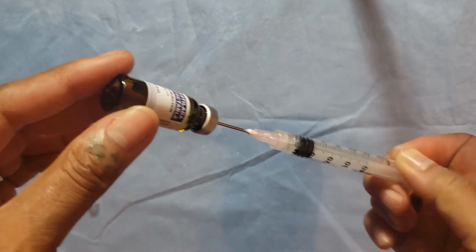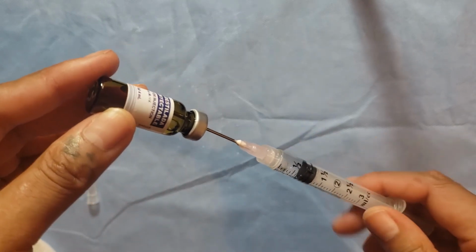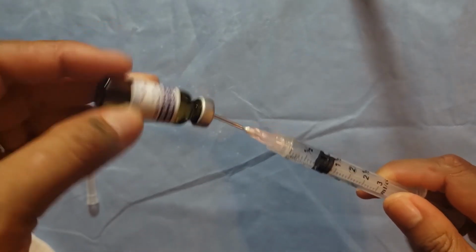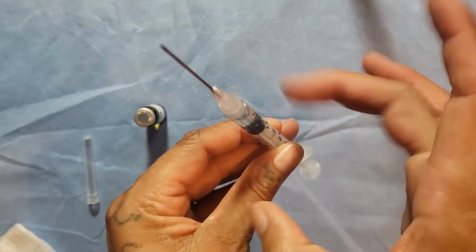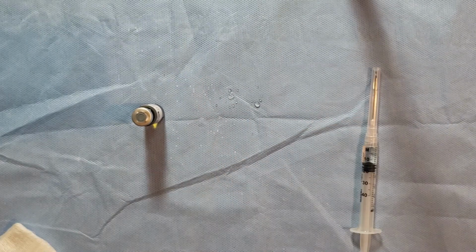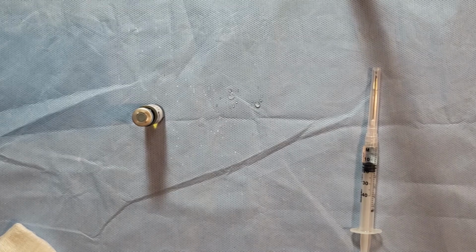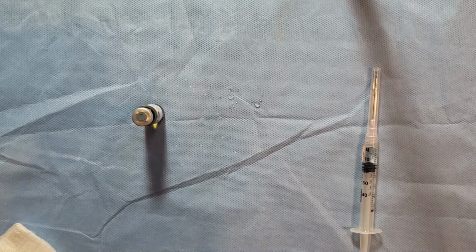Inject the air into the vial as you tilt the vial to avoid air aspiration to the syringe, and you will notice that the fluid automatically starts to fill the syringe. When you have the required dose, hold the syringe up and tap it to remove any excess air and ensure that the fluid is the correct amount. Be sure to change your needle since slicing through the rubber stopper compromises the quality of the needle and can cause increased discomfort when administering medication directly to the skin.